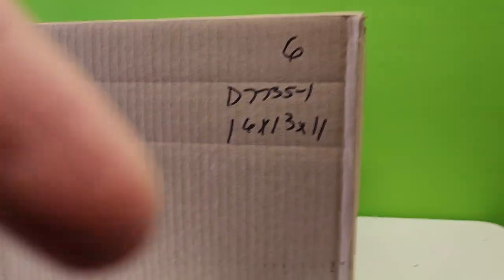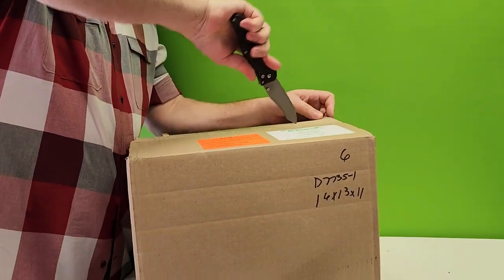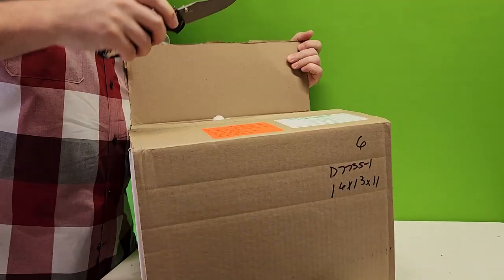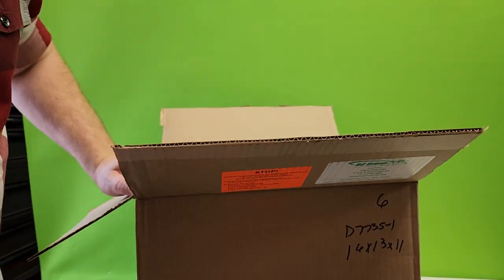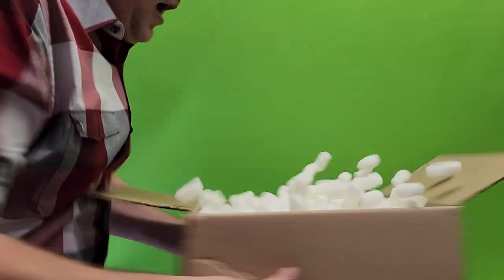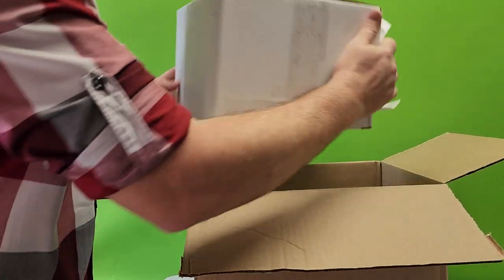Let's go ahead and open up the box and see what we got. I've got my assistant cameraman here - you should be my cameraman more often, this worked out well. There we go. I'm sure I'm going to spend the rest of my day cleaning up packing peanuts.